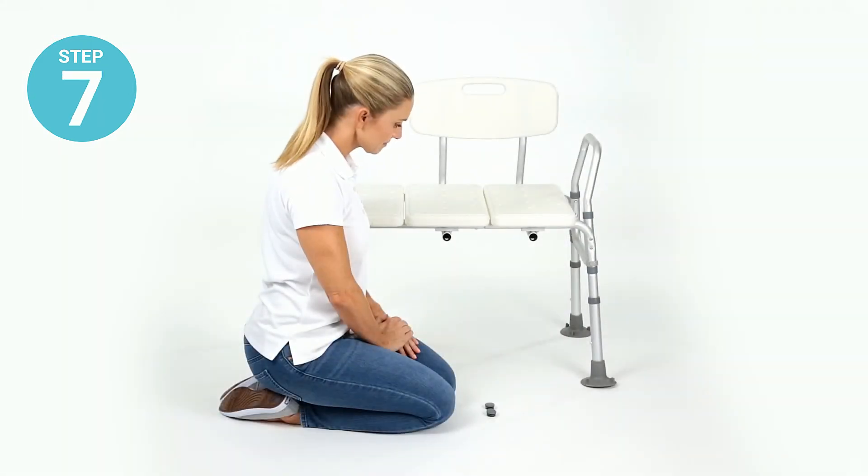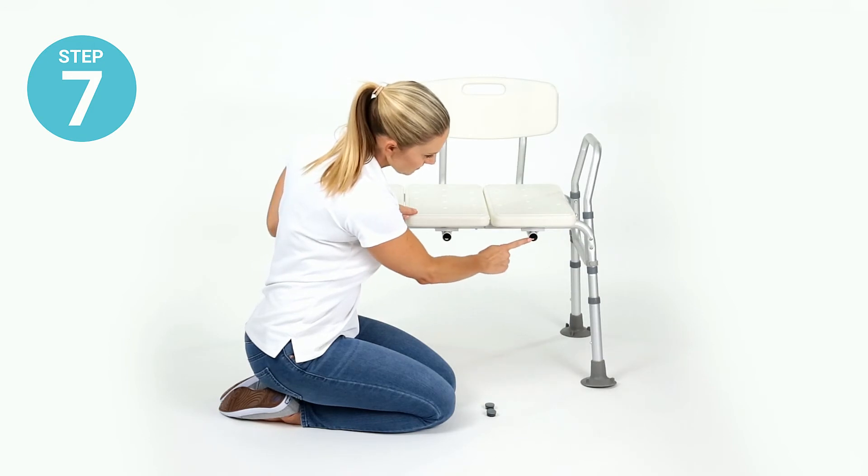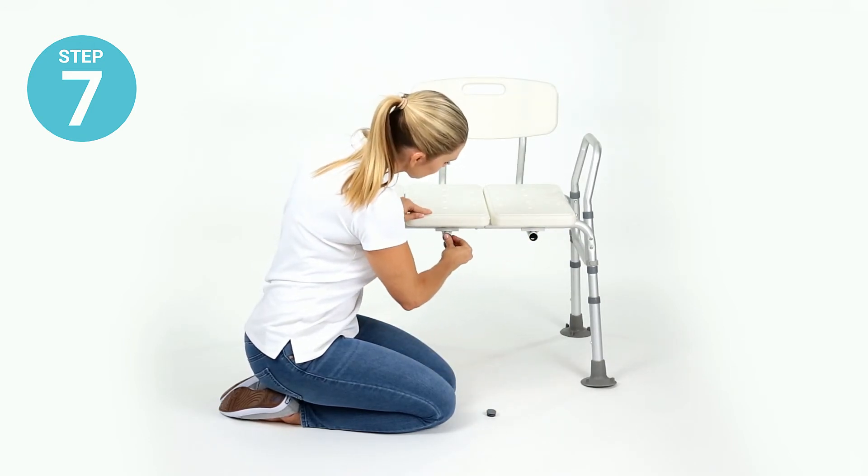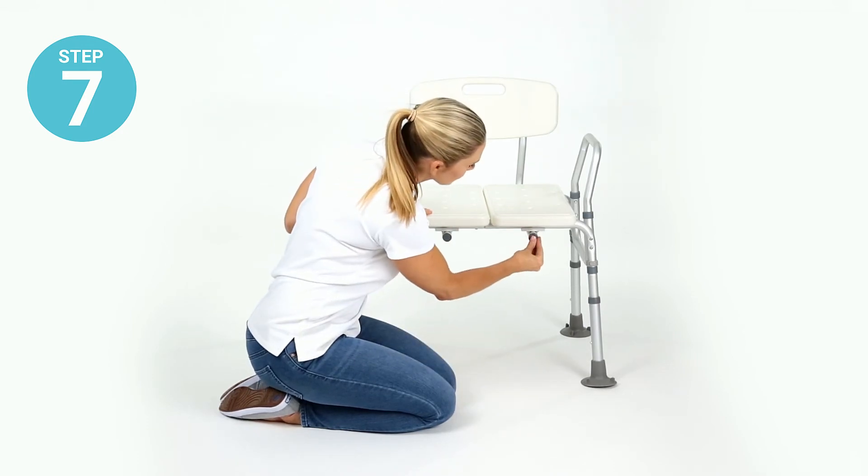Step seven: install the two backrest frame caps in the open sockets underneath the seat on the opposite side of the backrest.